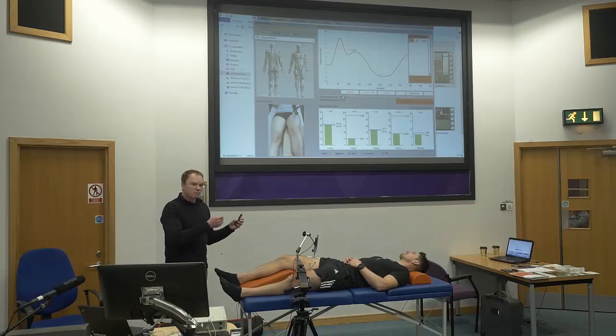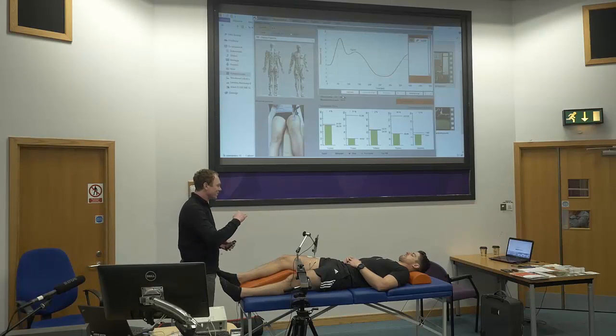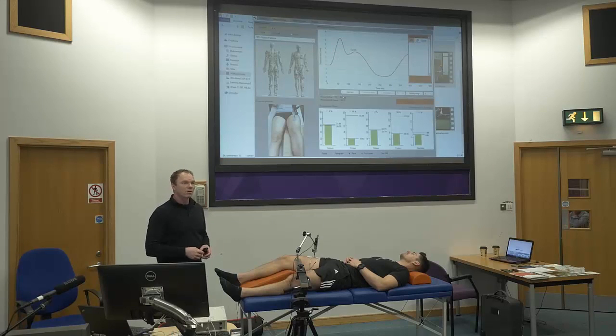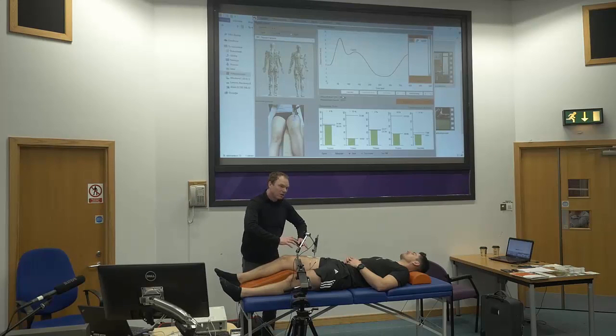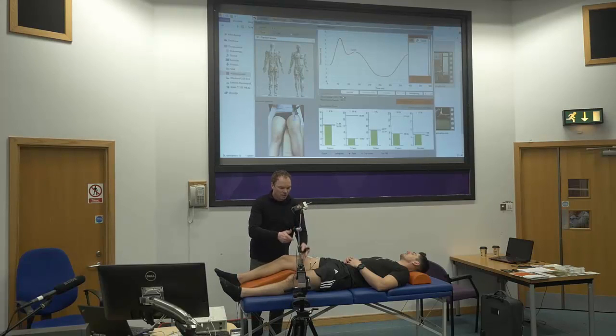Again, a little bit faster than the average — another 4%. Displacement is also quite okay. About the kicking motion that occurs during measurement of the rectus femoris: it doesn't affect the results at all. You can see these waves later in the curve — you shouldn't prevent it, because if you try to prevent the leg from moving in that direction, the whole leg will dip down, changing the angle in the knee joint, and the leg can actually move away from the sensor. You shouldn't force the subject to stay in position — it will not influence the results at all.